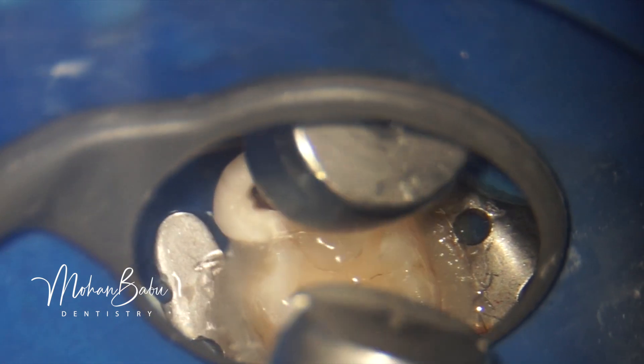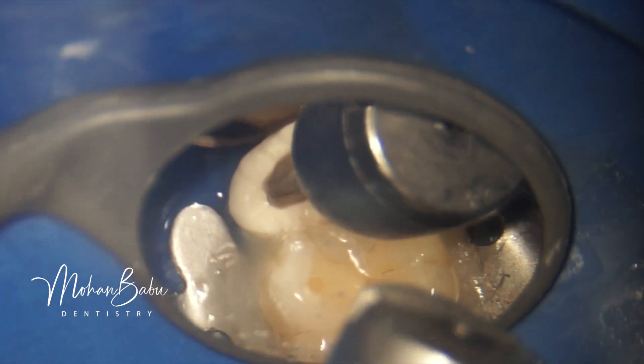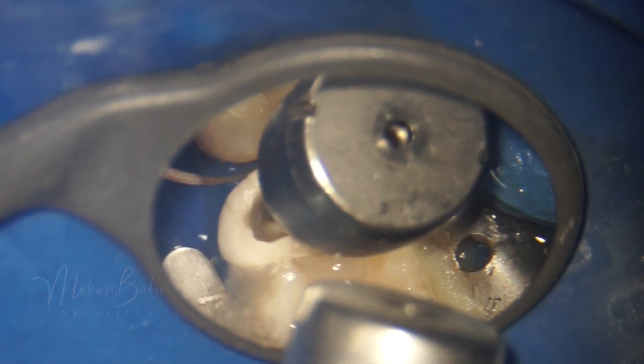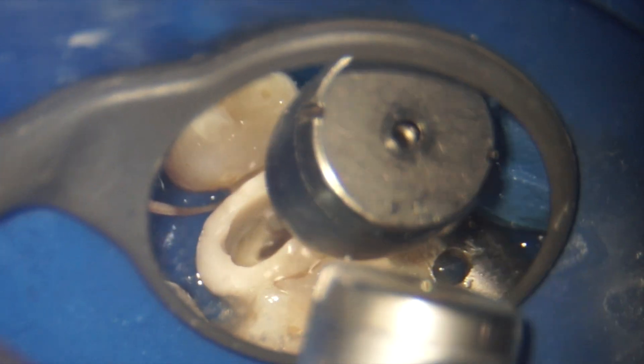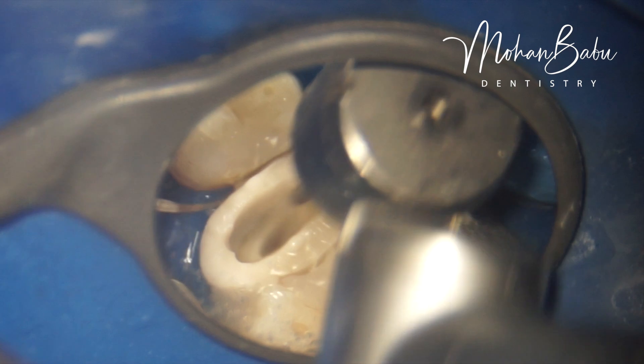The GIC pre-endo buildup was purposely done over-contoured, because only then can we eliminate the GIC where the core is supposed to come, while the remaining part of the GIC is retained as a matrix. Only by being over-contoured can it properly act as a matrix.